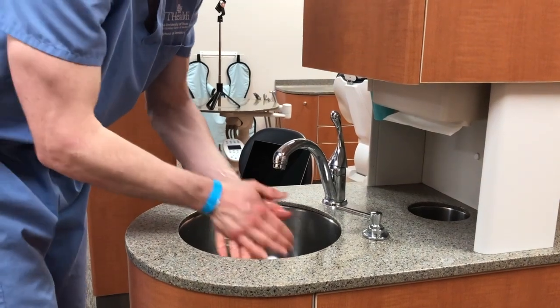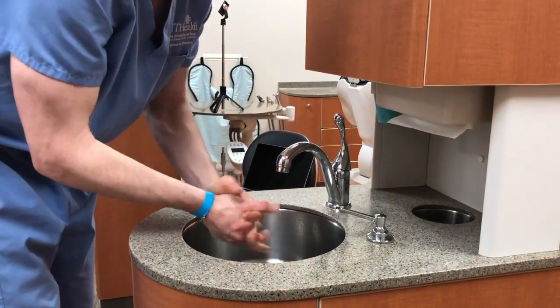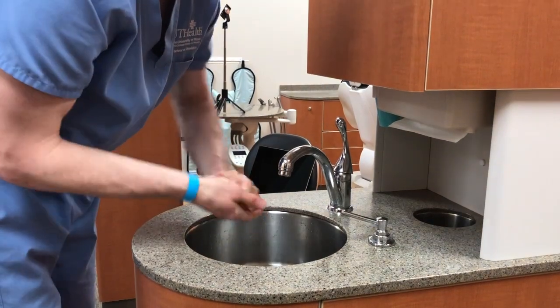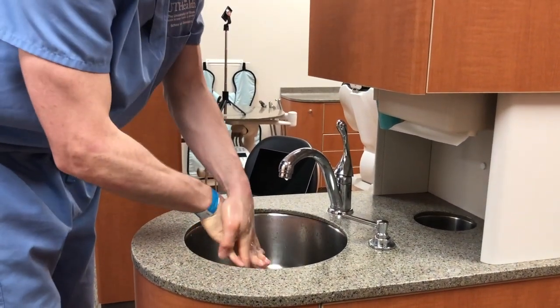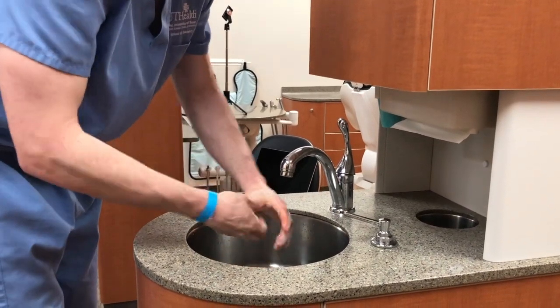You can now begin hand hygiene. Hand washing should be done for at least 20 seconds. Wash with soap and running warm water, taking care to reach all areas of your hands, including between your fingers, the backs of your hands, and your thumbs.